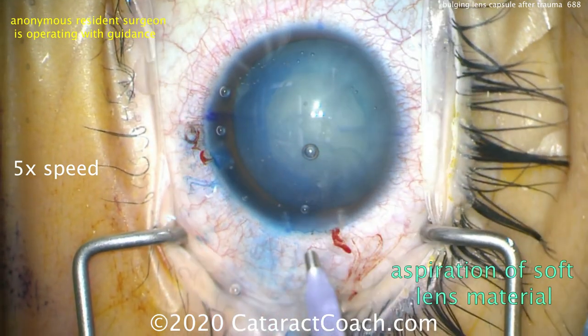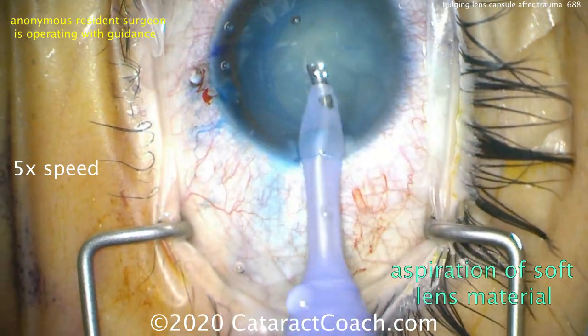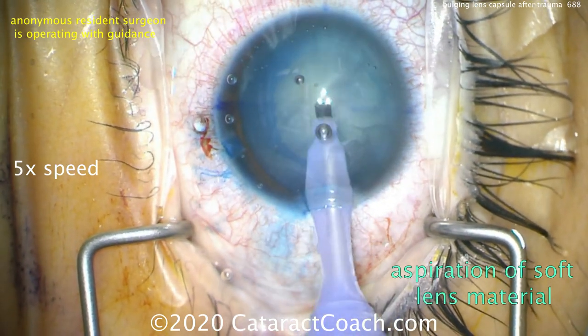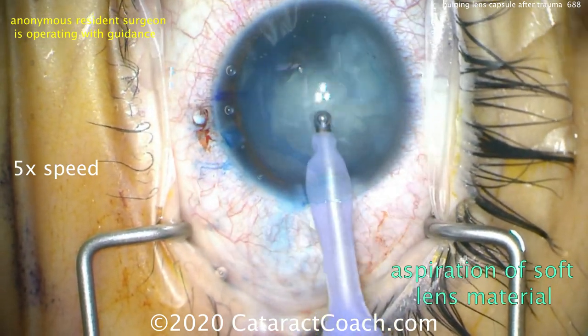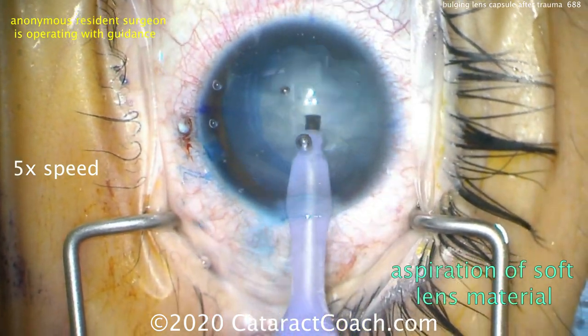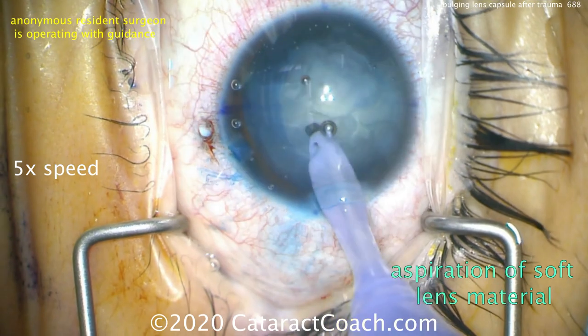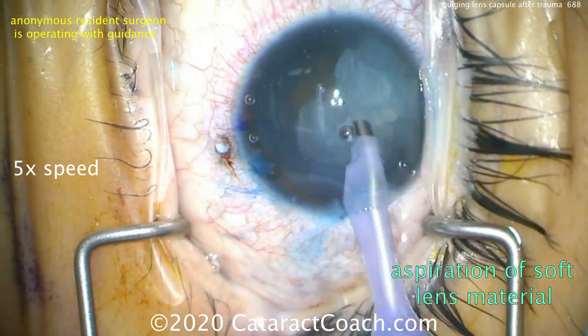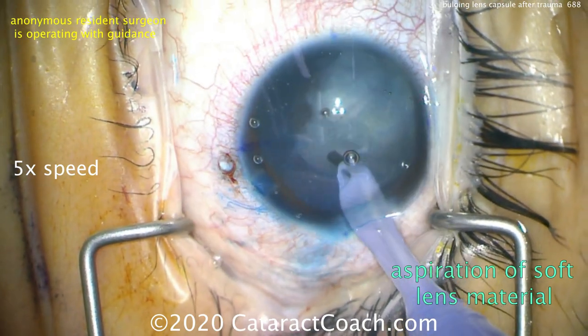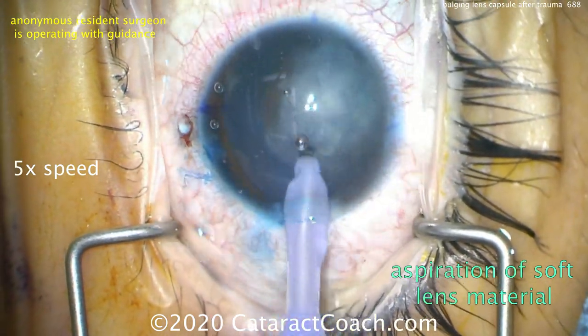There's the completion of the rhexis — that looks great. And here comes the phaco probe. There's not going to be much phaco energy needed, if any. You can simply aspirate out the lens material, because again this is a young patient and the lens material is very soft. Total ultrasound energy here is essentially zero; in fact, you could just use the IA probe to aspirate out all of the lens material.